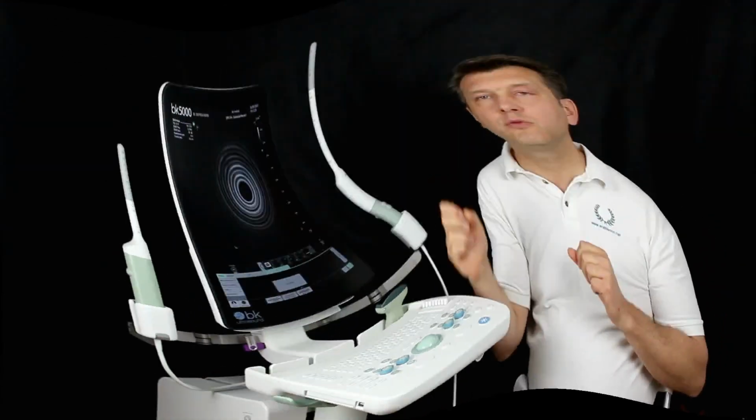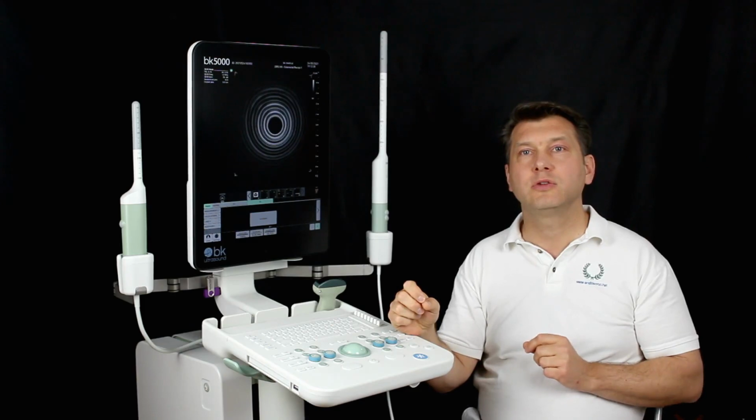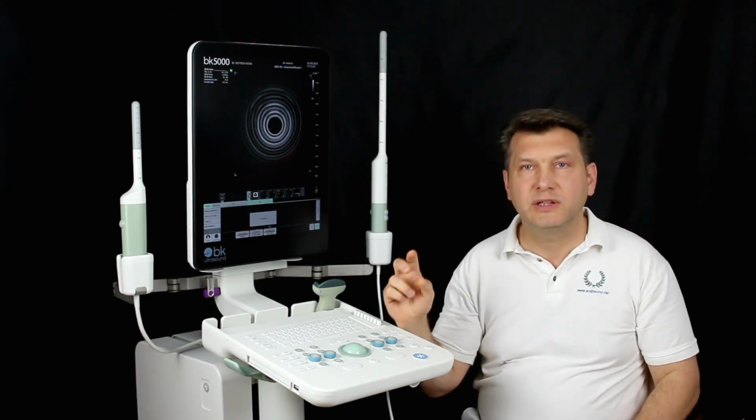As you see, a few rules must be obeyed. If you pay attention to these, the diagnostics will definitely succeed.